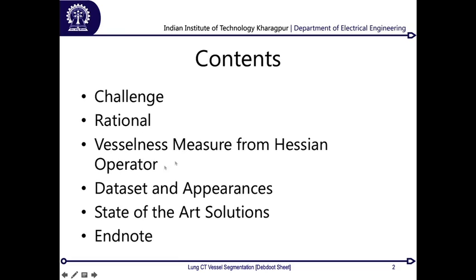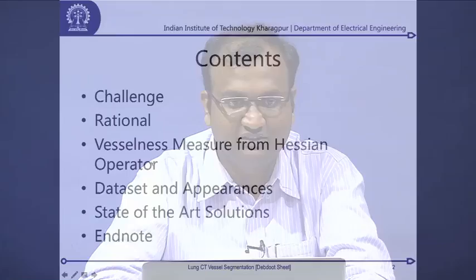This paper dates back to the late 1990s, and at that point of time there weren't any machine learning based techniques as we know today for segmentation of 3D objects, but we did figure out a way of using Hessian based operators and then finding the principal component vectors in order to figure out a vesselness response. So, that was one major prior art contribution and one of the strongest standing points from the perspective of vessel segmentation.